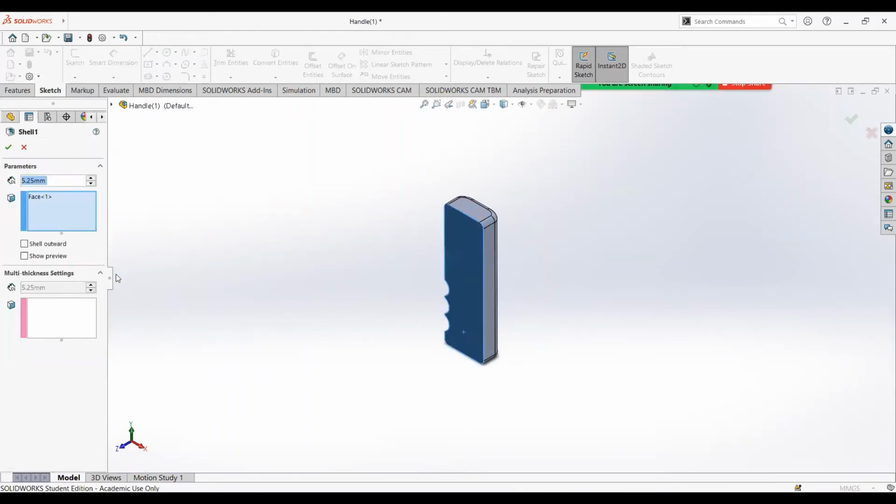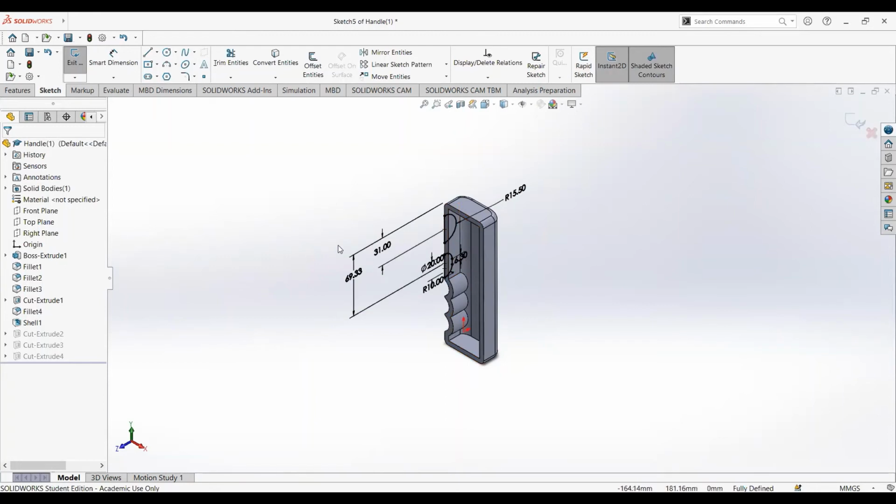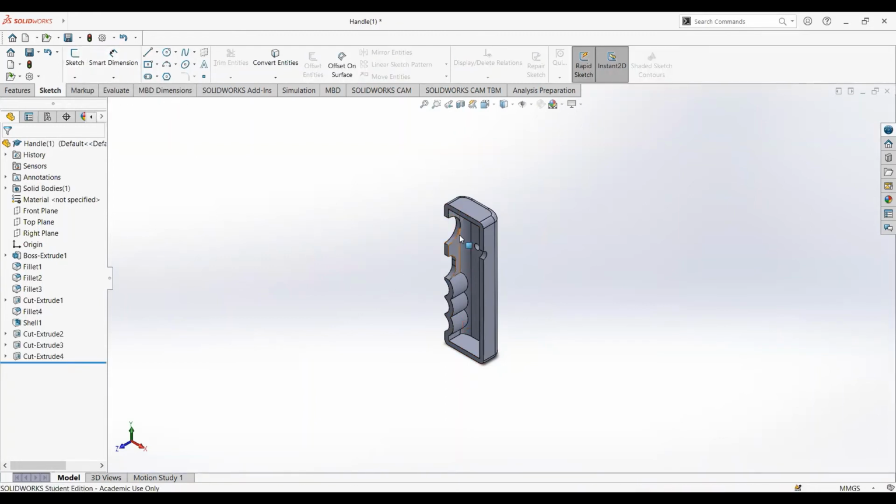Next, we did shell 5.25 millimeter right here. Then we sketched and are going to cut extrude this part. So here, this is going to be the shell for our rod, I'll show you next. And then this part, so our lever arm can fit here, and then there's going to be a button right here. So yeah, we cut extruded this too.